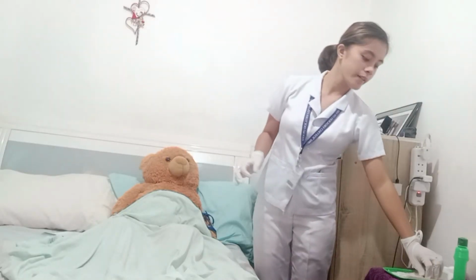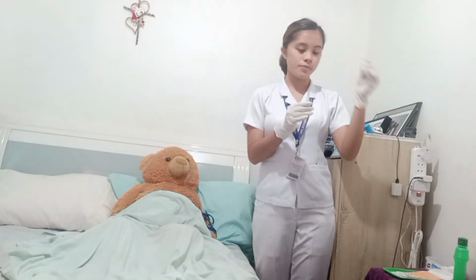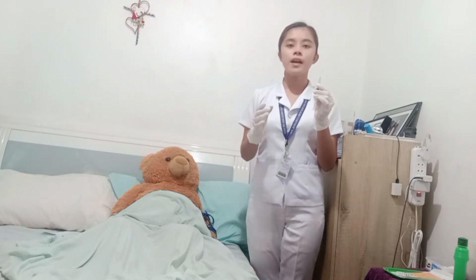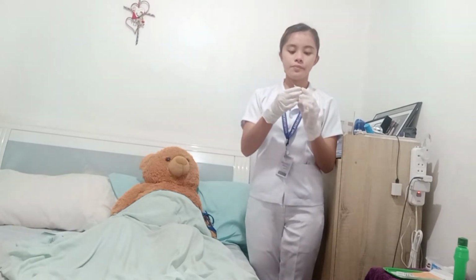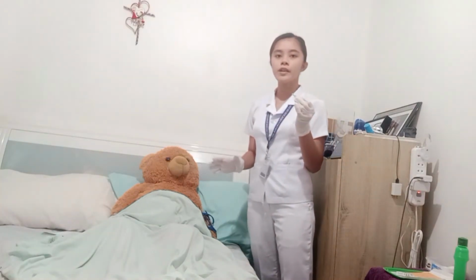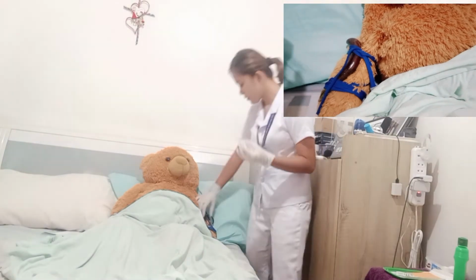Now grab the syringe and remove the cup by pulling it straight up. Now hold the syringe between the thumb and forefinger of the dominant hand as if holding a dart. Now grasp the area surrounding the site of the injection and insert the needle quickly and firmly at a 45 to 90-degree angle.